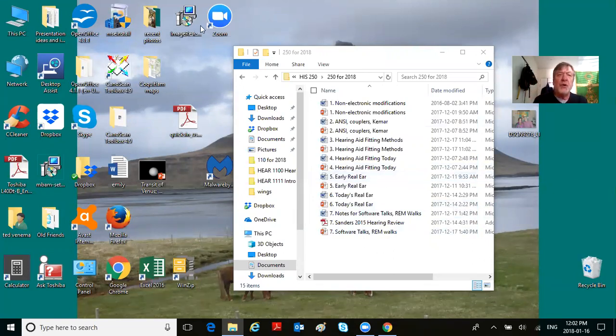What I could do, instead of measuring under headphones, then taking those off, and then putting a hearing aid in the guy's ear and sitting him in front of a speaker and measuring thresholds again, hoping that I increase the thresholds by half. So if the guy's got a 50 dB loss, now the hearing loss is 25. Or maybe I used a Berger fitting method or a POGO fitting method, and those are all variations of the half gain rule. I'm hoping to improve the threshold by the target of those fitting methods, which was always centered around half gain. They were all variations of half gain.